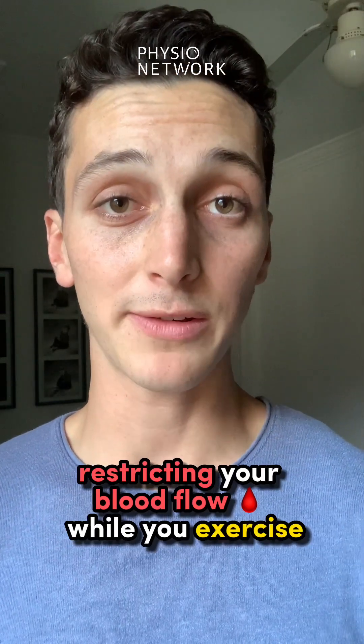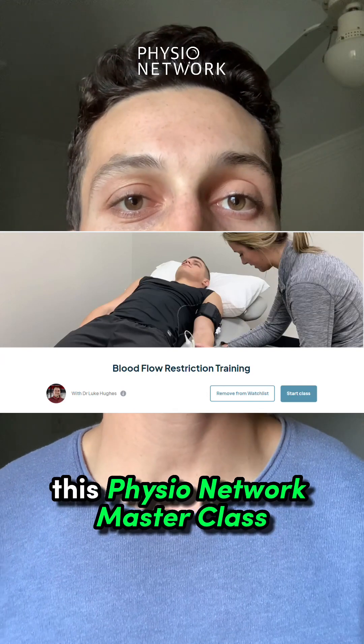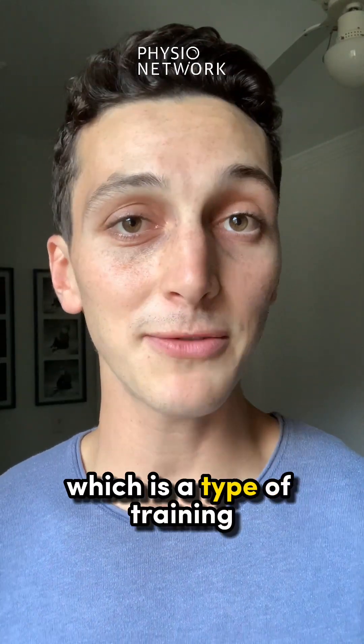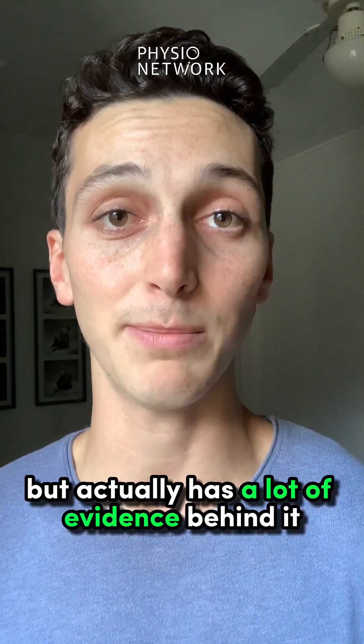Restricting your blood flow while you exercise can actually be a really good idea. This PhysioNetwork Masterclass looks at blood flow restriction training, which is a type of training that seems too good to be true, but actually has a lot of evidence behind it.